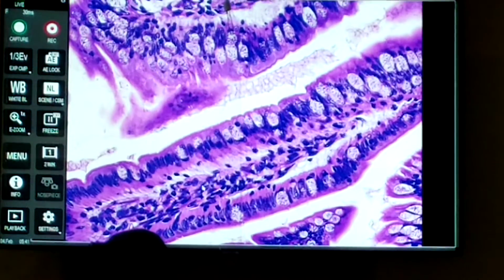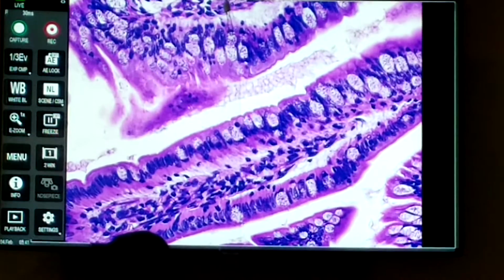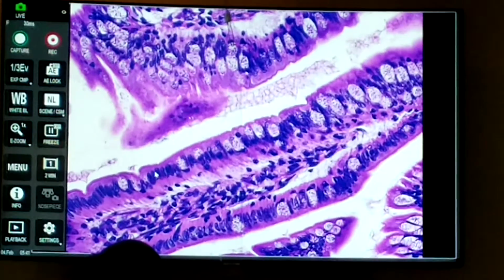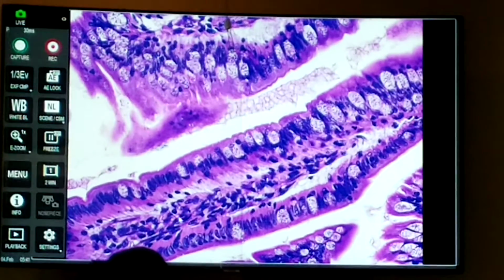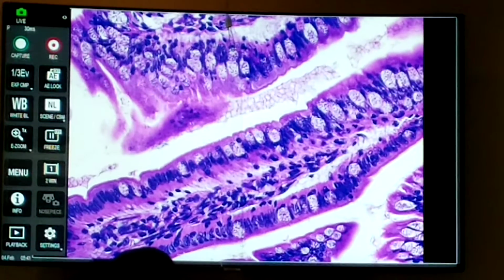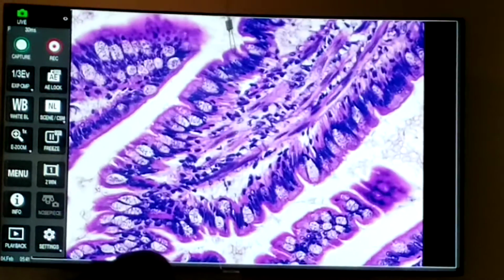And you can see in the lamina propria down here, you have lots of lymphocytes. Some of these lymphocytes are trying to move up toward the surface. There's a lymphocyte there. It's not like this one here. The nucleus looks different. This is lamina propria. On the other side is the other side of the villus here. And there's that brush border again. Make sure you can differentiate a brush border from cilia.